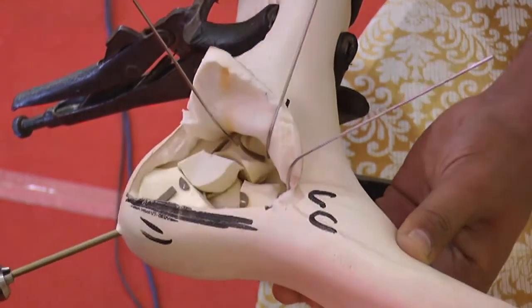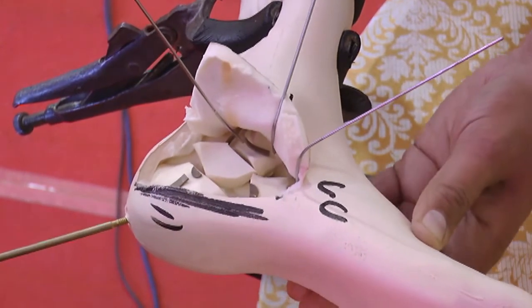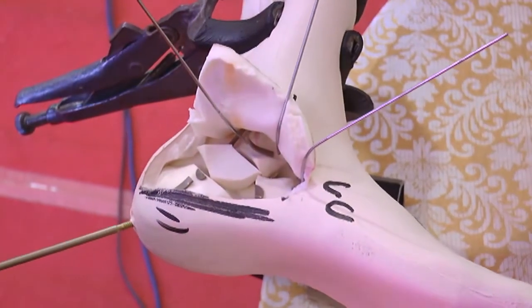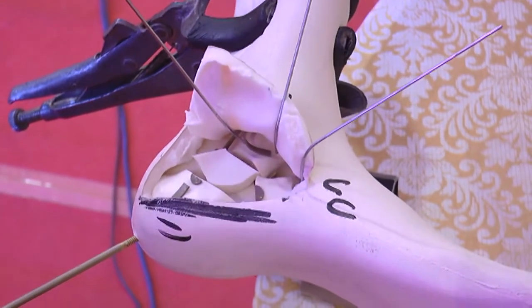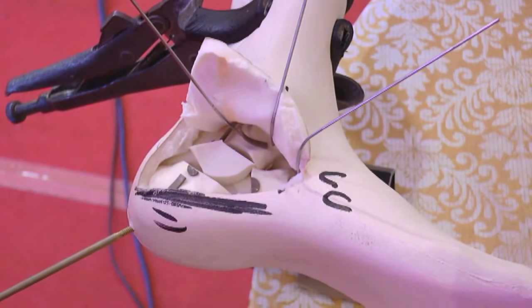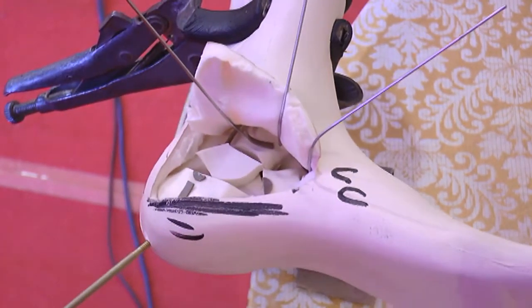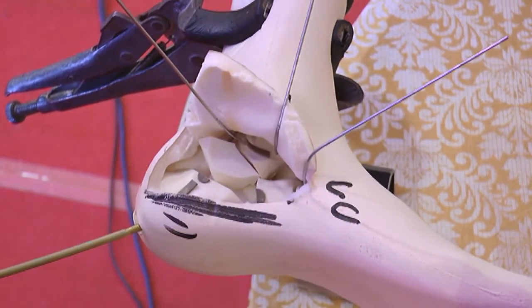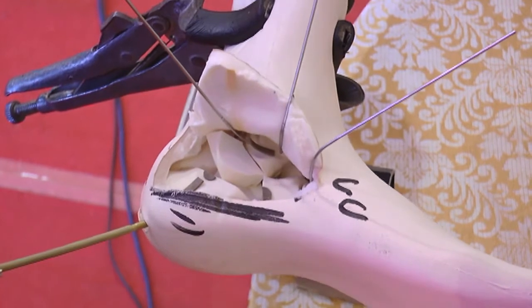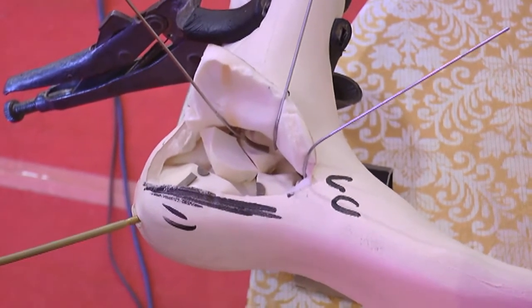When you have reached the fracture in the axial view, then you have to manipulate the tuberosity in two maneuvers. One is bringing the tuberosity down, because of the impaction the tuberosity is also tilted and the inclination angle is less. So you have to bring the tuberosity down with this maneuver and lift up your hand to take it out of varus. And in this position, you can replace your drill bit and use a T handle here.